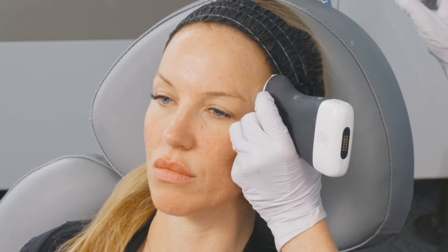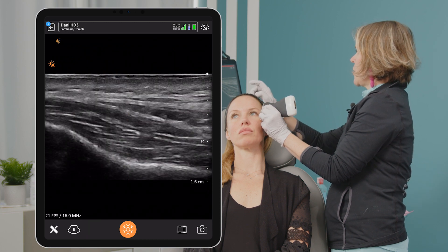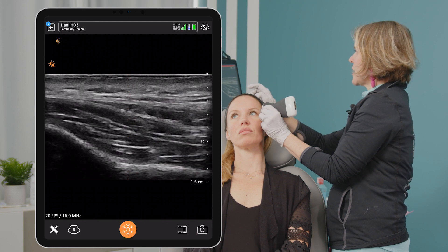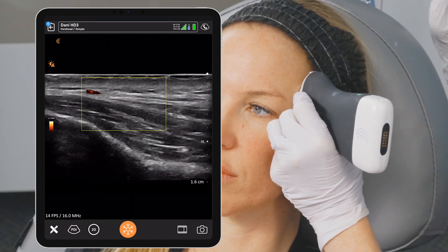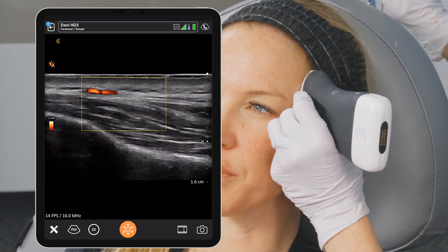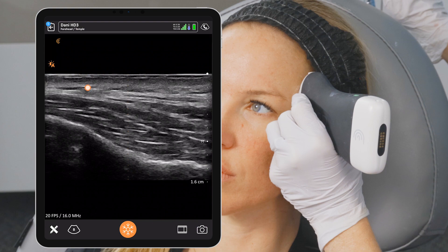I'm going to quickly show you: with my probe on, we're going to see that this artery is visible on Doppler, and then we're going to go back to B-mode where we can still visualize that layer and see that little tiny pulsation in that same layer. I'm putting it back to power Doppler just so you can see — here's the artery on Doppler — and now back on B-mode, we still see it.